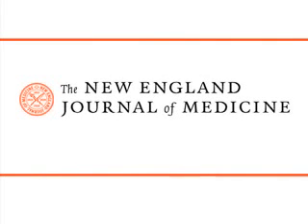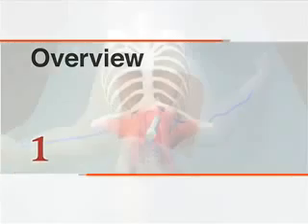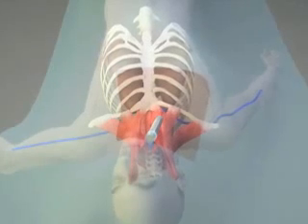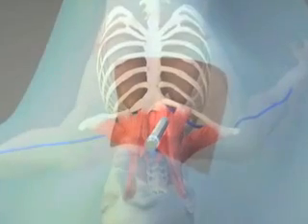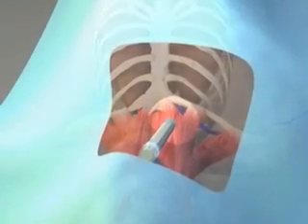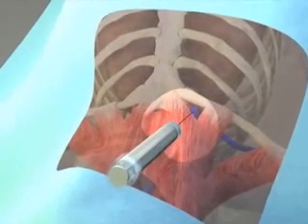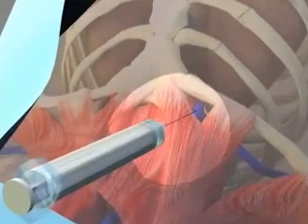This is a video in clinical medicine from the New England Journal of Medicine. The placement of a central venous line is an essential technique in the treatment of many hospitalized patients. This video will demonstrate the placement of a central venous catheter in the internal jugular vein using one of several variations of the Seldinger technique. An additional video on subclavian line placement will be forthcoming.